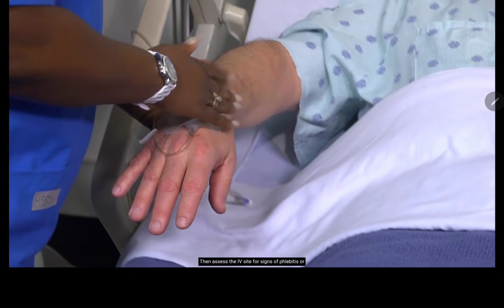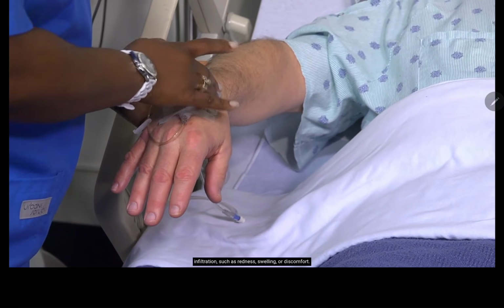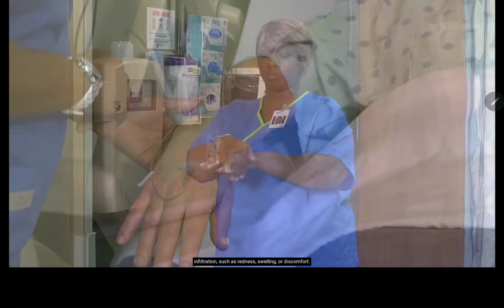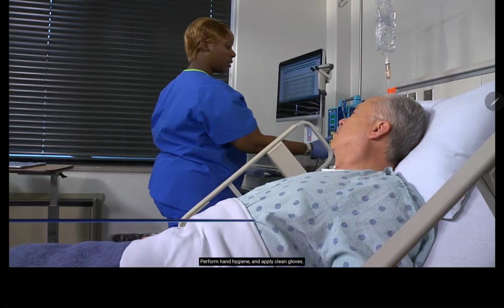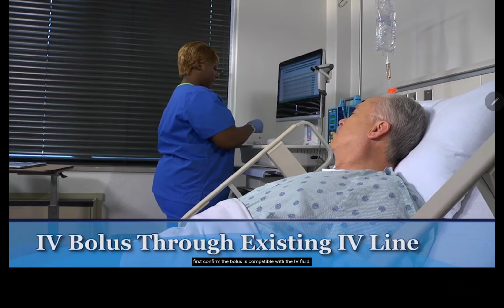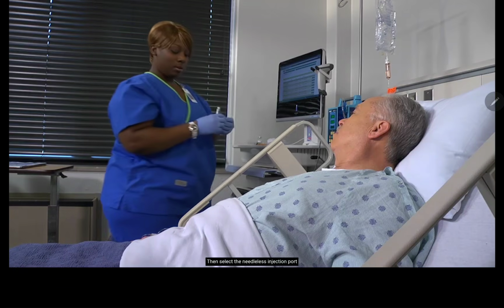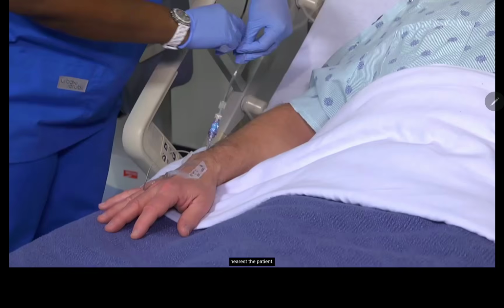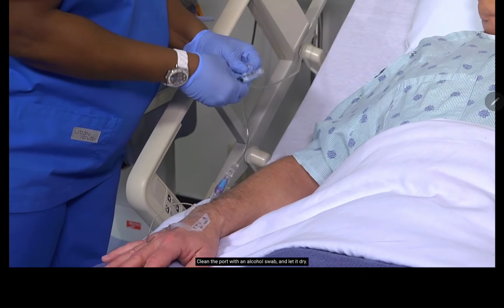Then assess the IV site for signs of phlebitis or infiltration, such as redness, swelling, or discomfort. Perform hand hygiene and apply clean gloves. To deliver an IV bolus through an existing IV line, first confirm the bolus is compatible with the IV fluid. Then select the needleless injection port nearest the patient. Clean the port with an alcohol swab and let it dry.